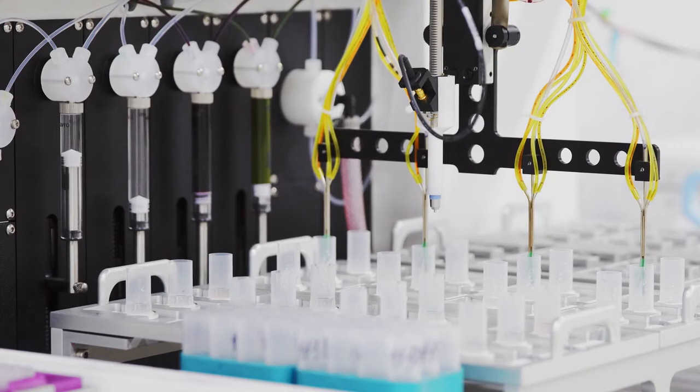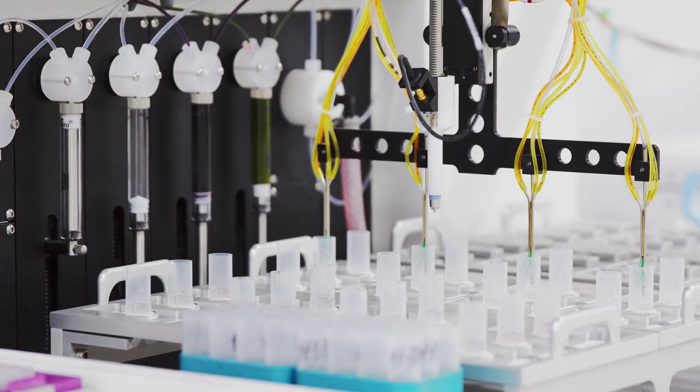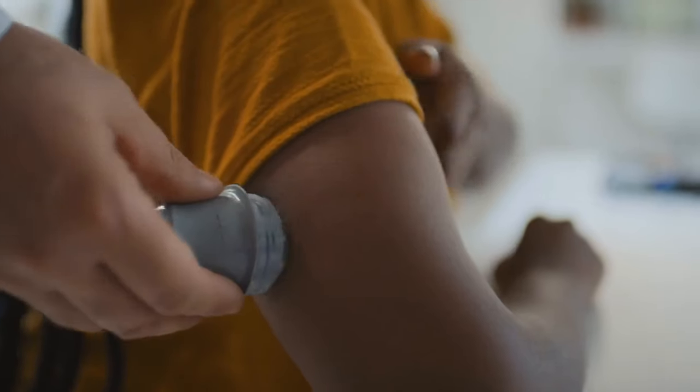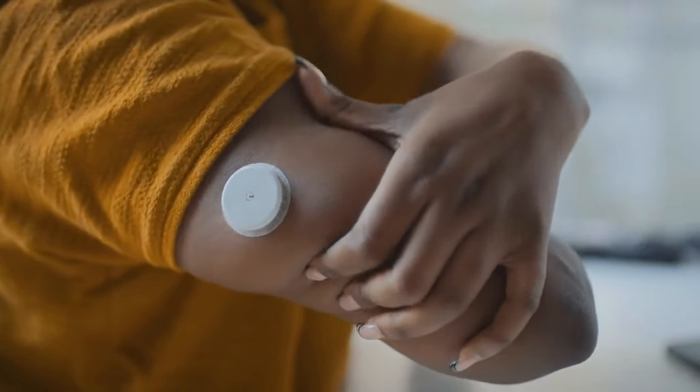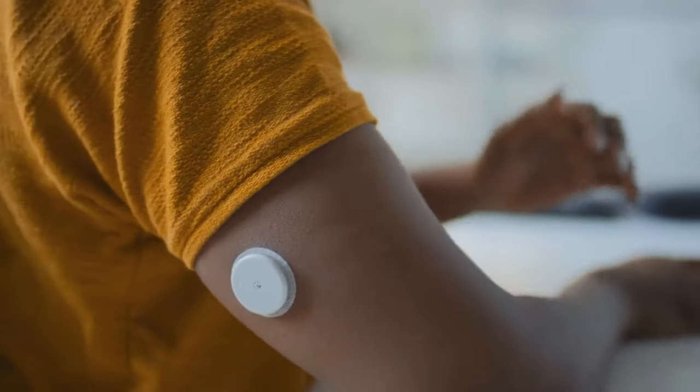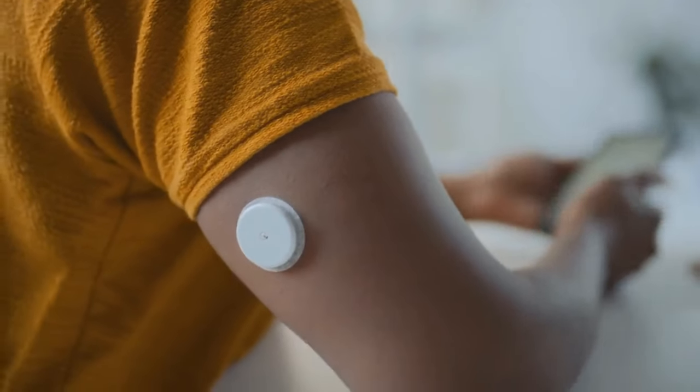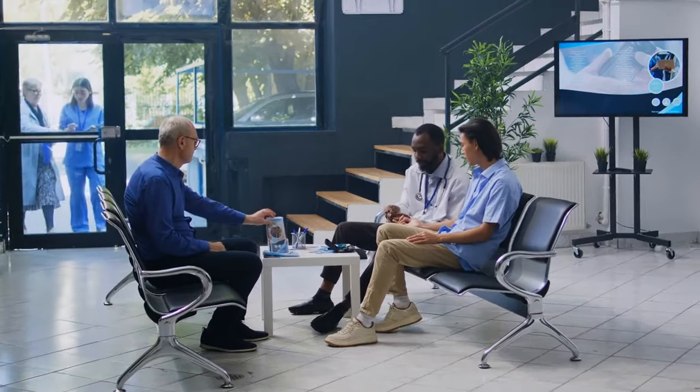So in Diana's story, the CGM system monitors her blood sugar level continuously and delivers insulin shots according to the result. These devices work 24-7.